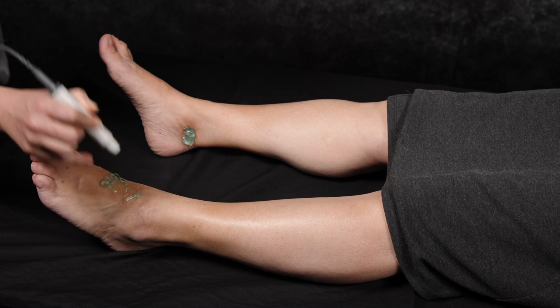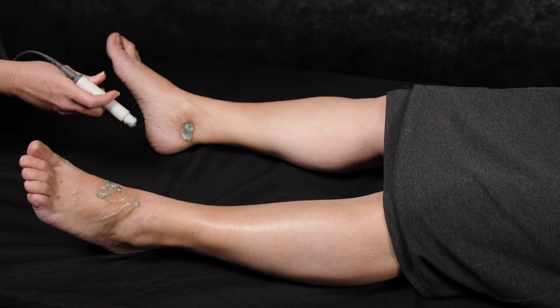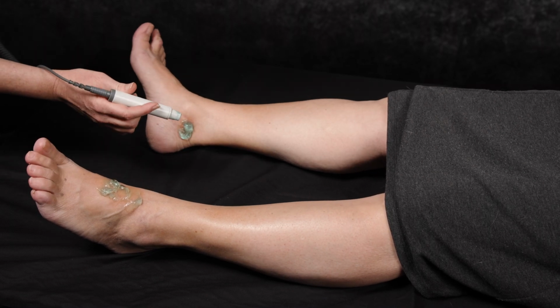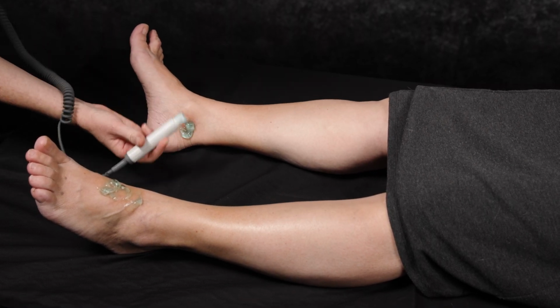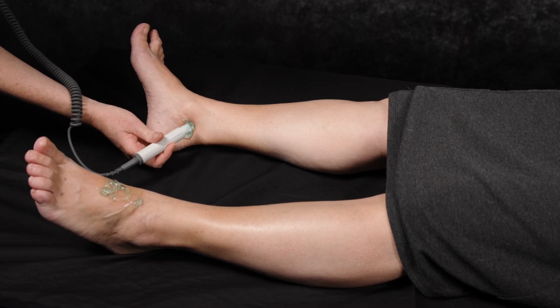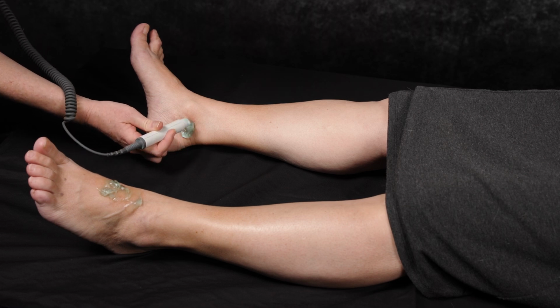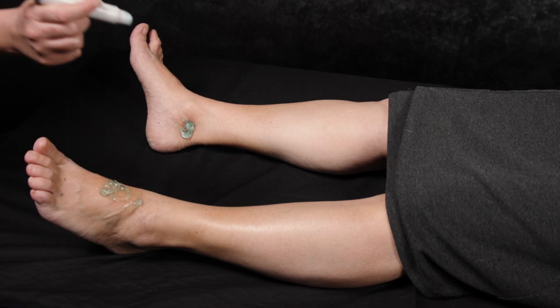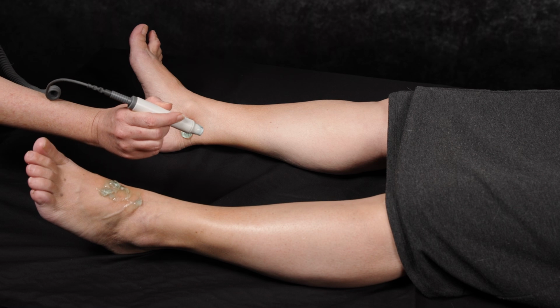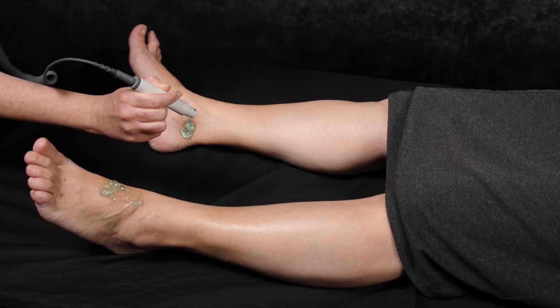Similarly, the posterior tibial arteries can be difficult as well, particularly when you've got lots of edema. So it is handy to anchor your hand to the foot or to the heel just to make sure you've got a good grip on the Doppler and lots of control. We use a pencil style grip. You can see how I'm holding it like a pencil, which gives you a good amount of control.